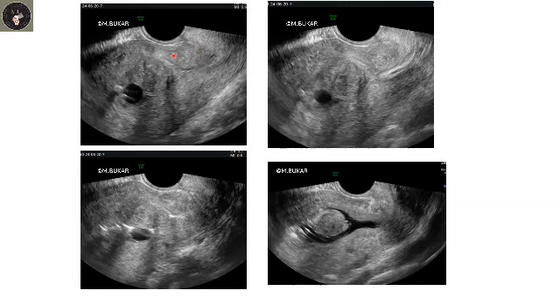This is the anterior lip of the cervix, posterior lip of the cervix, cervical canal, well circumscribed lesion within the endometrial cavity, and this is the catheter balloon within the endometrial cavity. And this is the pitfall I want to address.